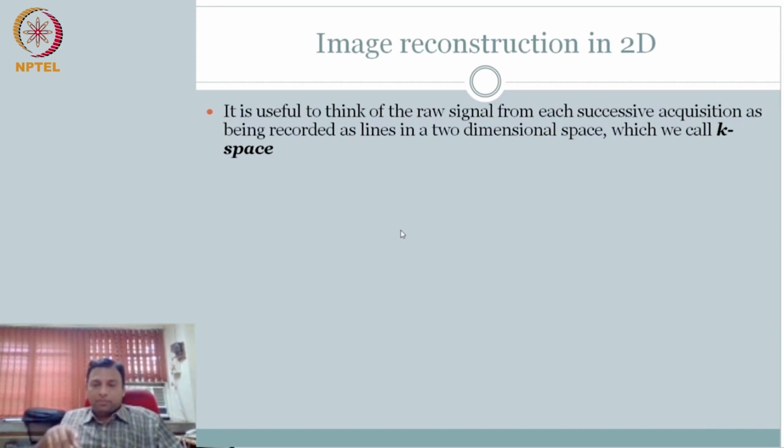So one cycle is a lambda. In your time domain, frequency. So the number of lambdas in the 2 pi length is usually a wave number. So it is convenient when you talk about spatial frequencies. People talk about frequency in terms of K space. K is referring to the wave number. Okay, so that jargon is still there.